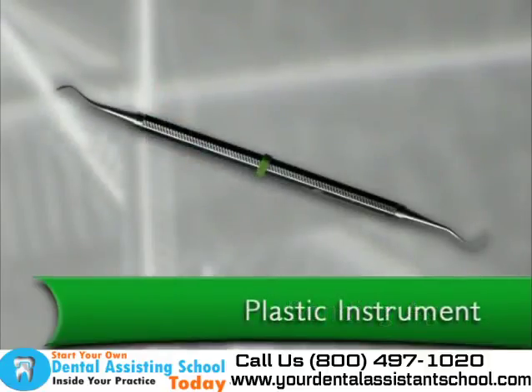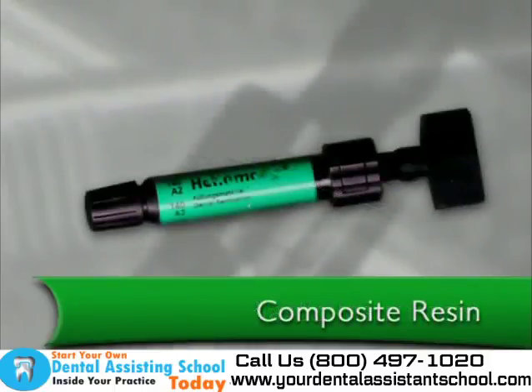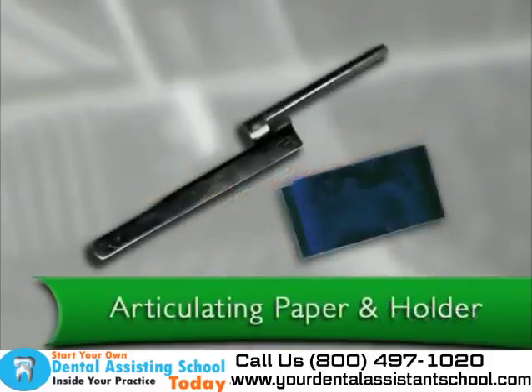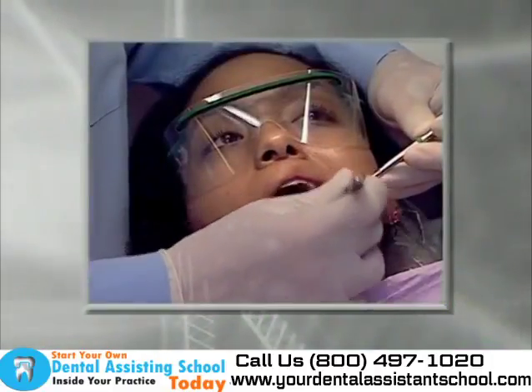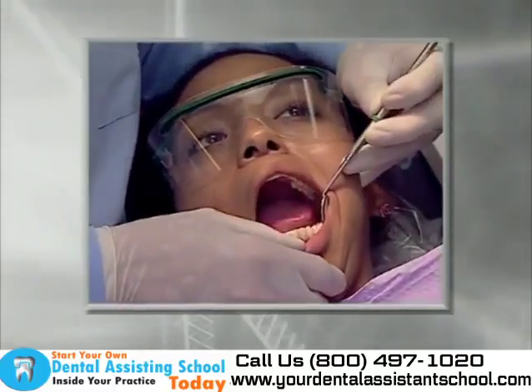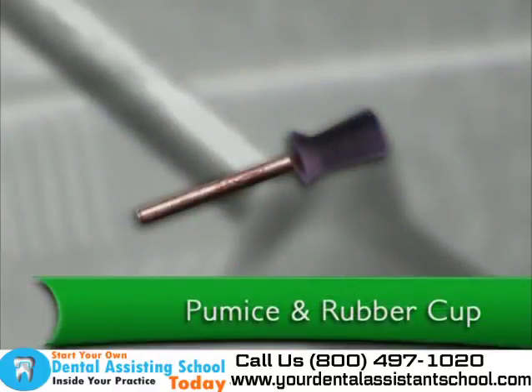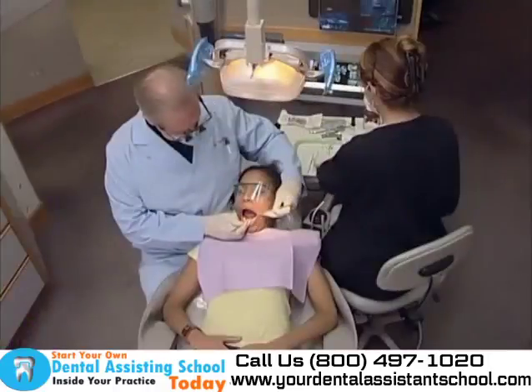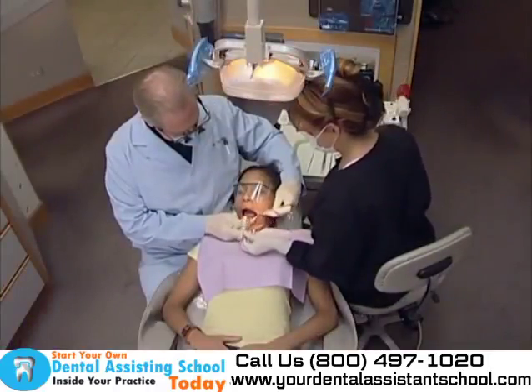A plastic instrument for placing a variety of materials into the cavity preparation. Composite resin comes in a variety of shades, from matching the restoration to the patient's natural teeth. A wedge for separating the teeth. Articulating paper and holder for denoting a patient's bite pattern. The paper contains an ink-like substance that transfers onto a patient's teeth when the patient bites down on it. A rubber cup and pumice for polishing the restoration. Polishing paste, used to smooth the composite material after placing in the tooth. And any hand instruments the dentist may request.